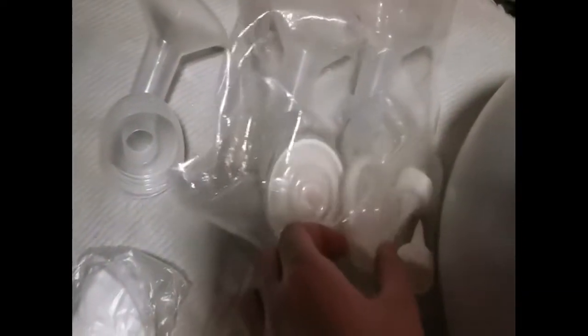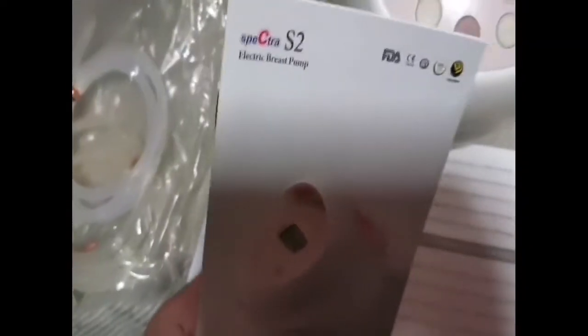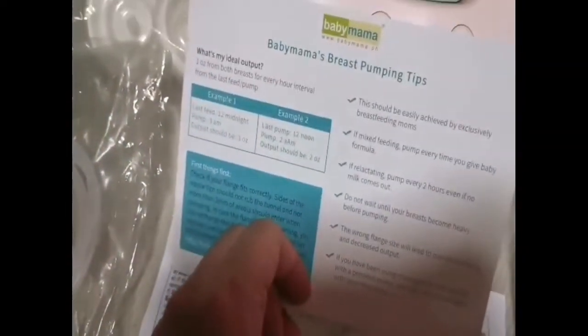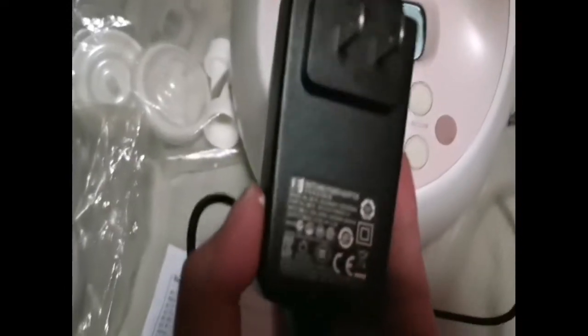And a pair of valves — I got an extra breast shield just because of the sizing. It also includes a pair of tubing and an instruction manual, some breastfeeding tips from Baby Mama — by the way, I got this from Baby Mama — and also the charger of course.